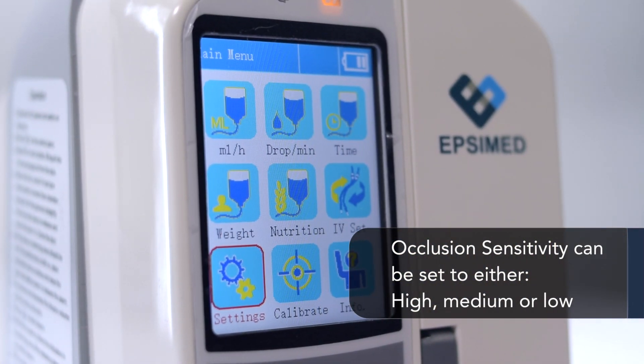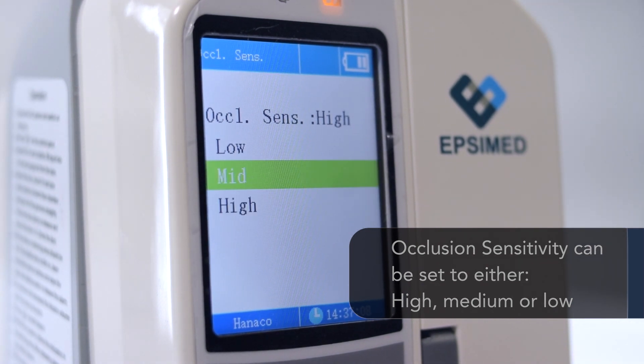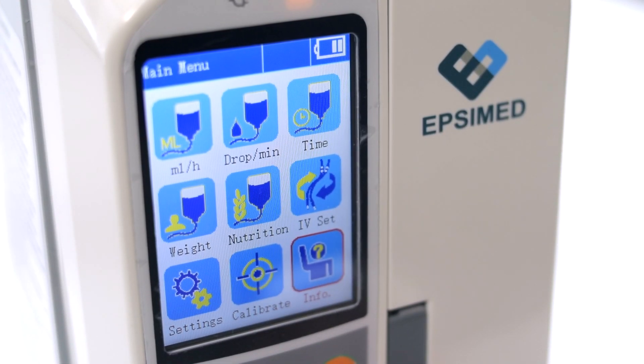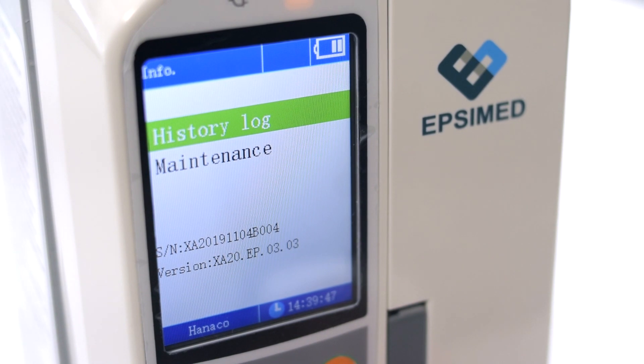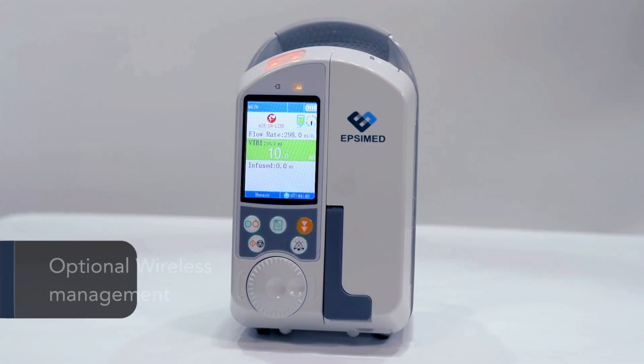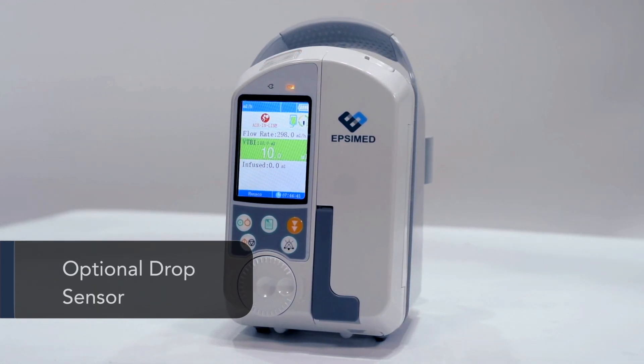Occlusion sensitivity can be set to either high, medium, or low. It provides a history log of up to 50,000 events, with optional wireless management and an optional drop sensor.